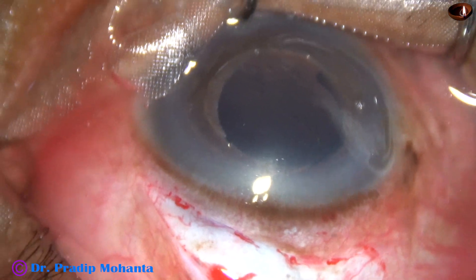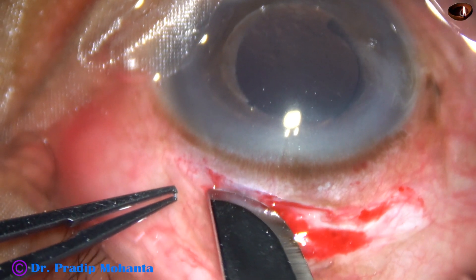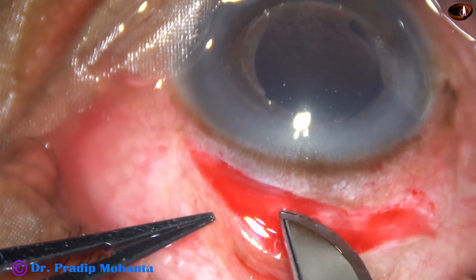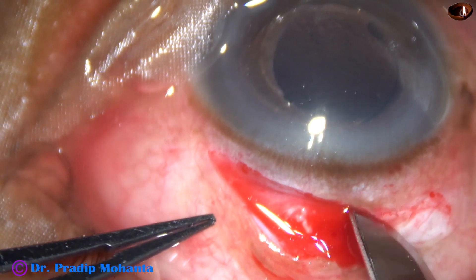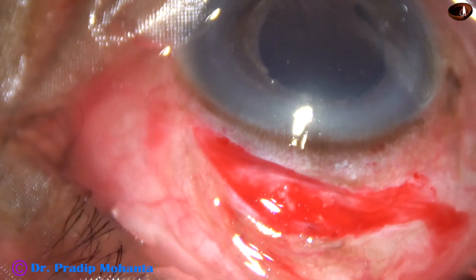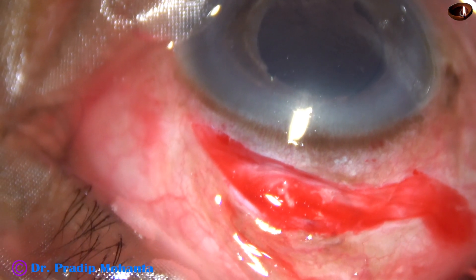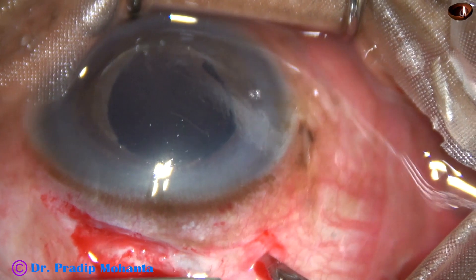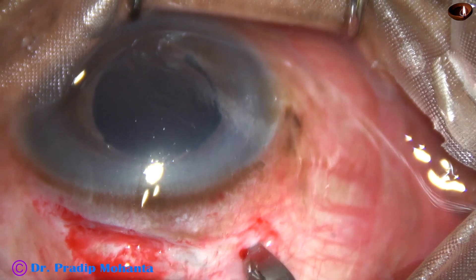I take a 15-number blade and apply this incision. This incision is probably coinciding with the previous SICS incision. And now this is a sclerotomy.